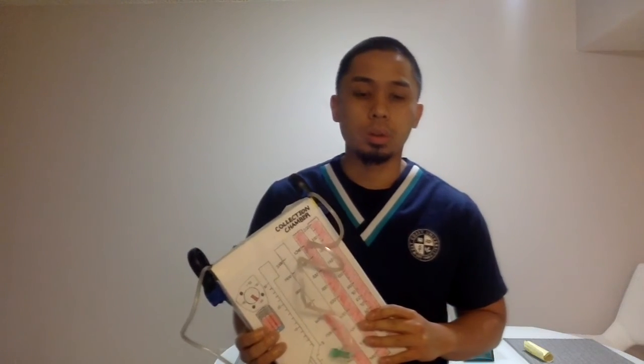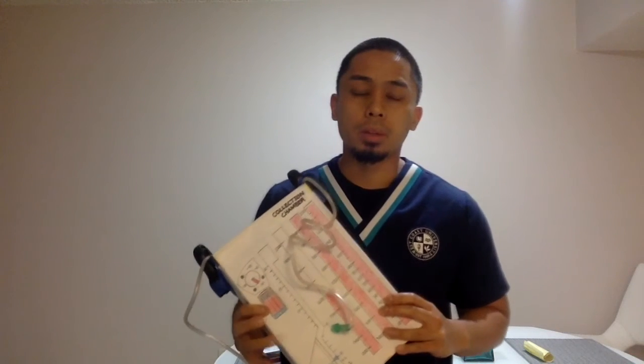So now that we have finished the procedure, what's next is that we have to document. And so what I would document is to know that the patient did sign the informed consent. We want to note the date, time of the insertion, and we want to note the location where it was inserted. We want to note the size of the tubing and the reason for the insertion, and we want to note any breath sounds, any respiratory rate, and the O2 saturation after the insertion.